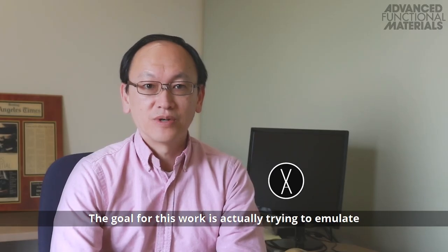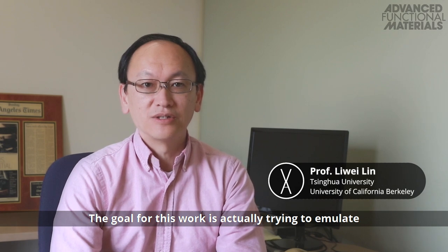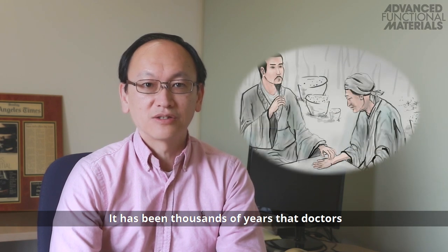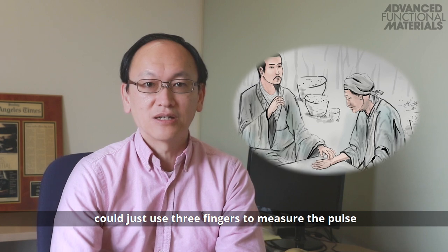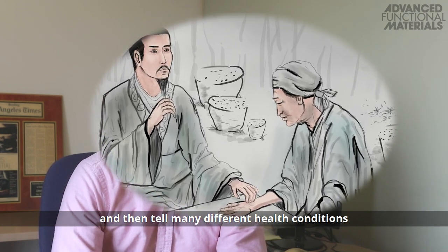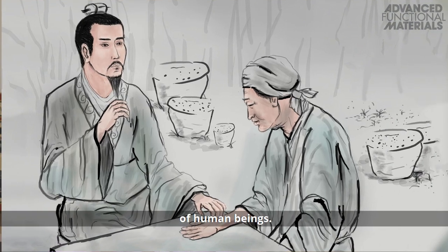The goal for this work is actually trying to emulate traditional Chinese medicine. It's been thousands of years that doctors could just use three fingers to measure the pulse and then tell many different health conditions of human beings.